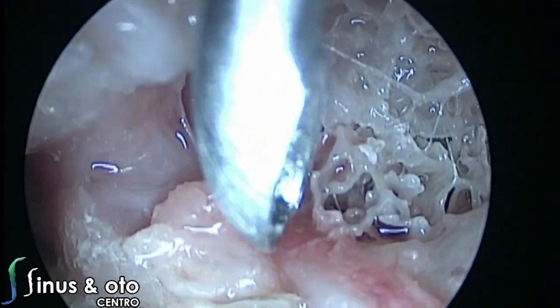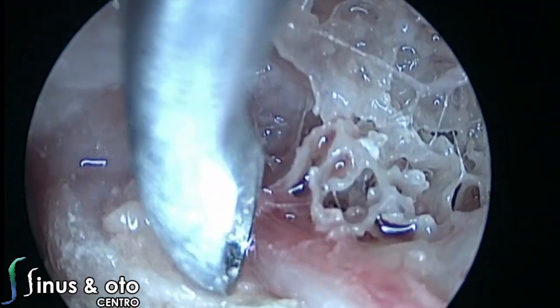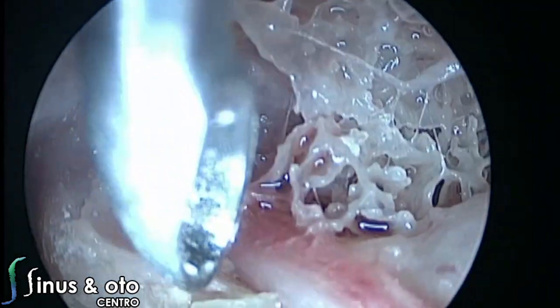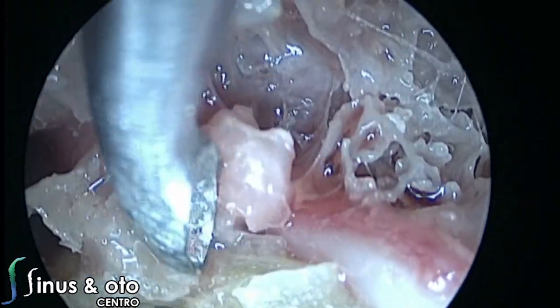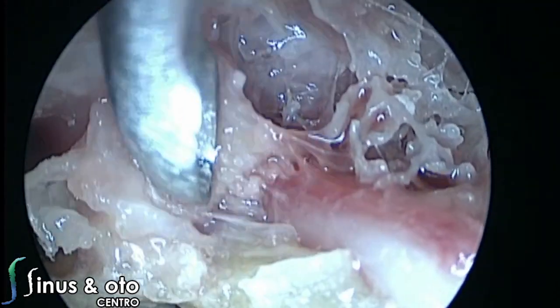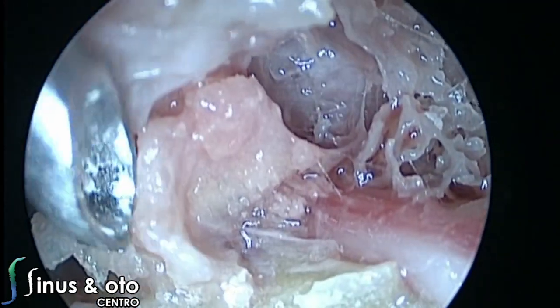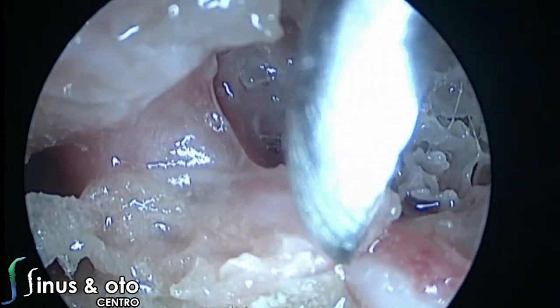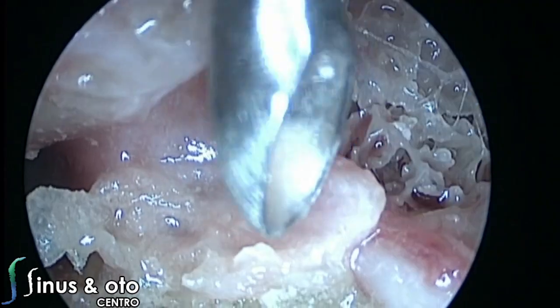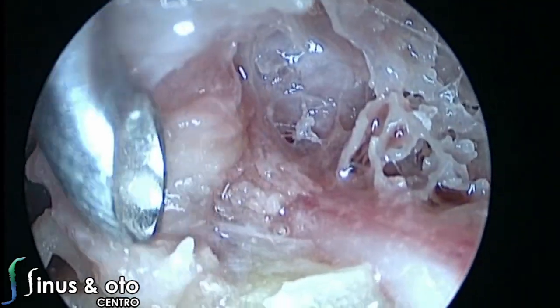So the cochleariform process is a very important anatomical landmark, but it does not mean that you are right over the geniculate ganglion. The geniculate ganglion is a little bit more anterior than the cochleariform process, so we elevate the muscle and then we see the geniculate ganglion over there. And the geniculate ganglion is the first genu of the facial nerve between the labyrinthine segment that we saw on this transpromontorial endoscopic approach and the tympanic segment, which we are seeing now.